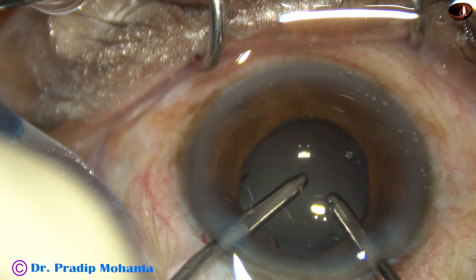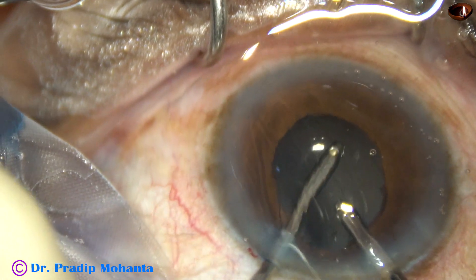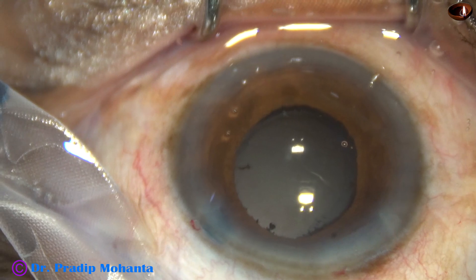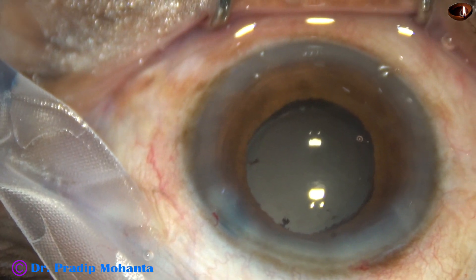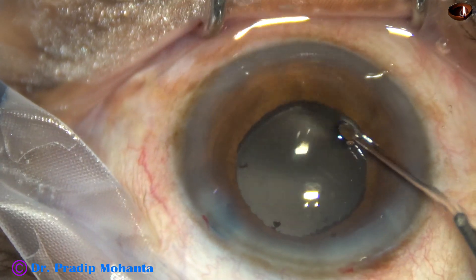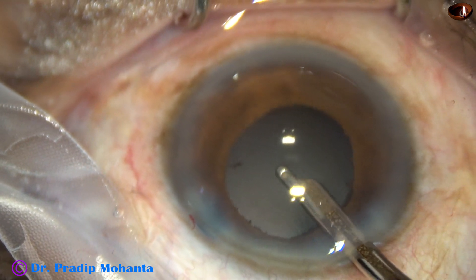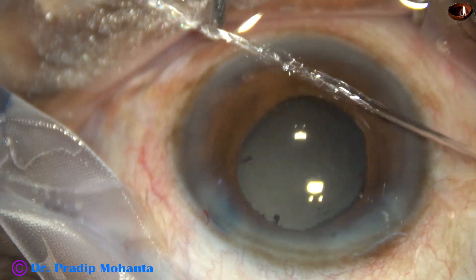Here the aspirating port is through the side port and the irrigation is through the main incision. The anterior lip of the main incision is lifted up and this minimizes leakage of fluid. So the visco is nicely removed. And now the single side port is closed by hydrating the corneal stroma on either side of this stab incision. This is the final lavage of the anterior chamber.